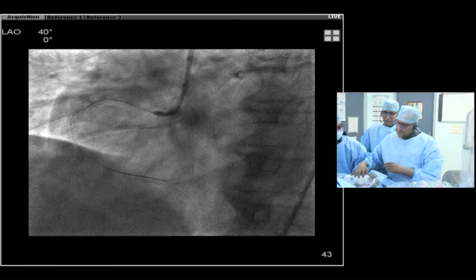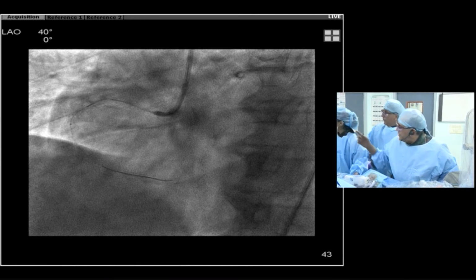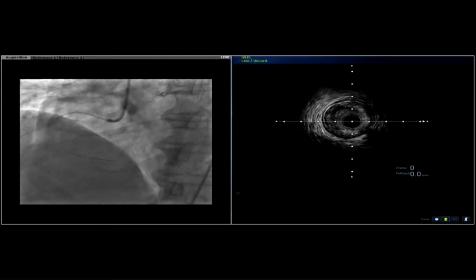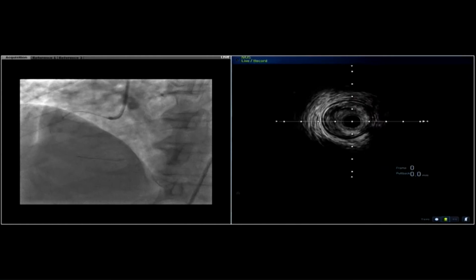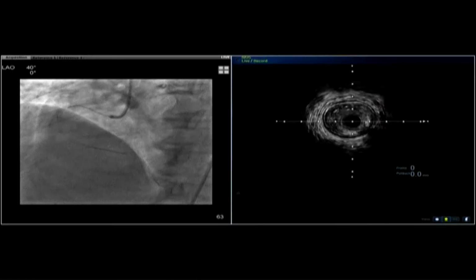Yeah. And this is, again, I know Miroslav said it before. Show me the IVUS. For those of us that have orbital, it's really nice because basically the wire is really nice, and you can do it through a 6 French guide extension as well. So you really don't have to switch your setup.